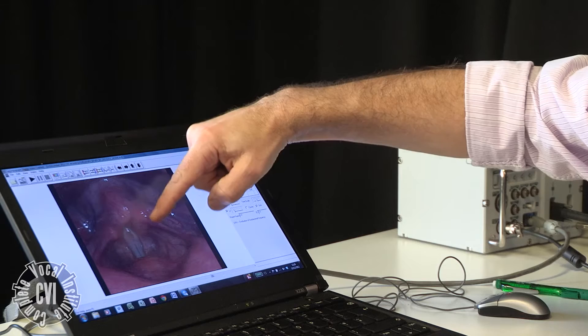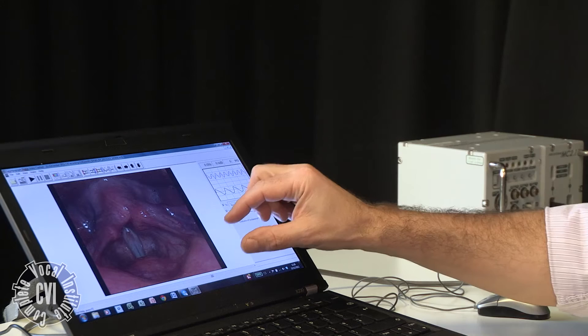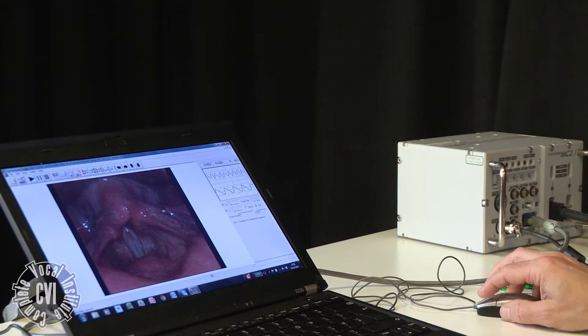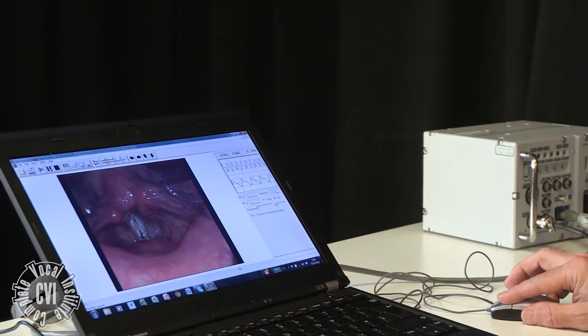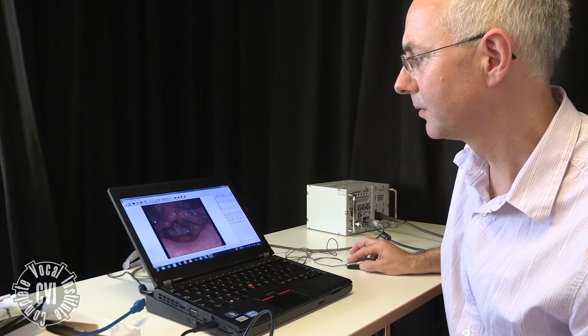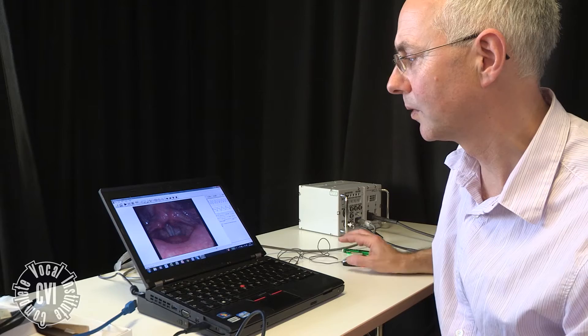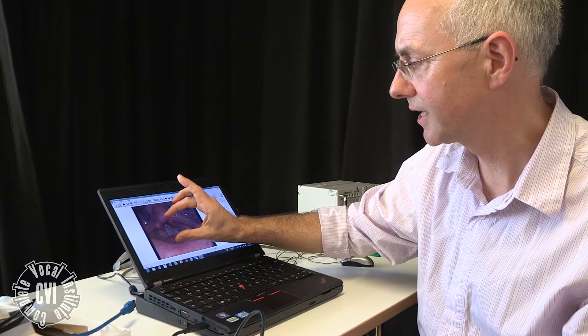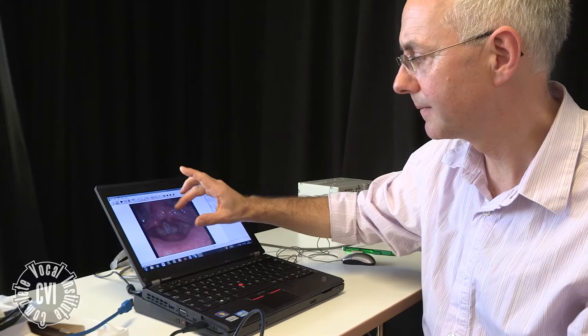You've got the false cords on either side and you've got the ariepiglottic folds between the cartilages, which are called the arytenoids, and the epiglottis here. We look at the vocal folds and how they vibrate, and we can see them vibrating because we're using the stroboscopic light. This is an example of a singer producing overdrive, and what we see particularly is a degree of narrowing between the cartilages at the back and the epiglottis, and it looks a little oblong in structure.